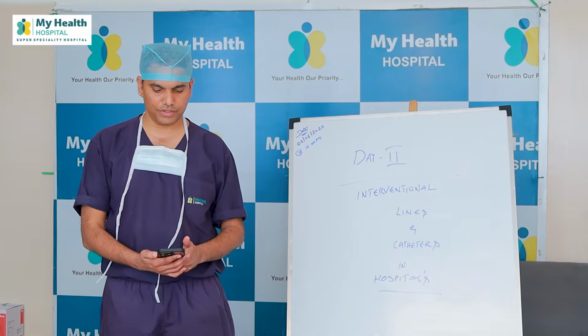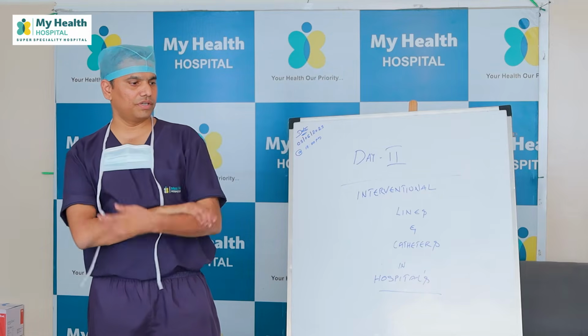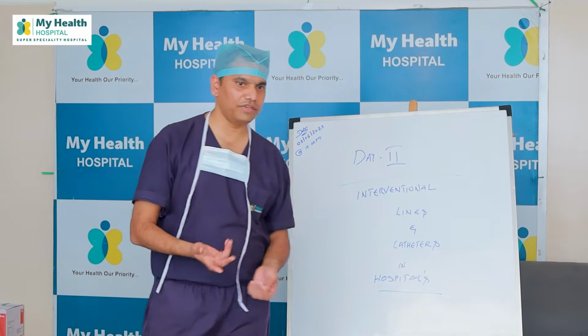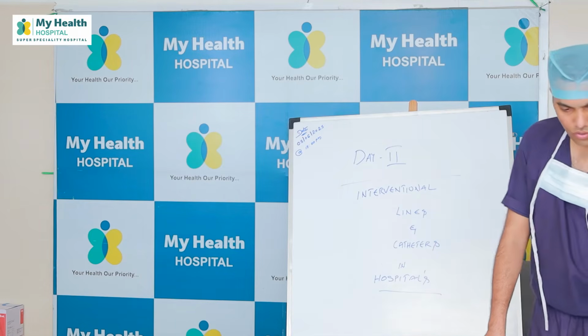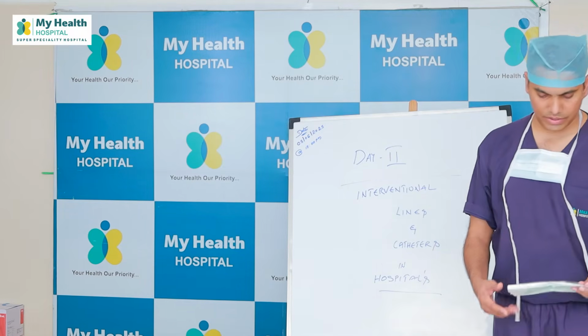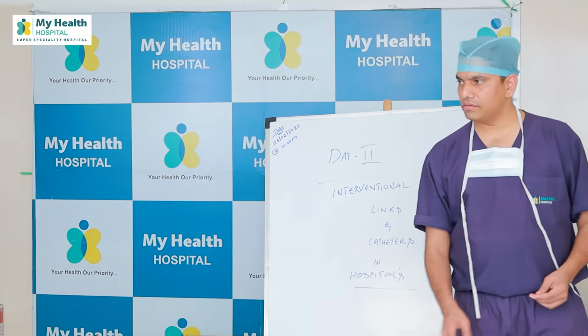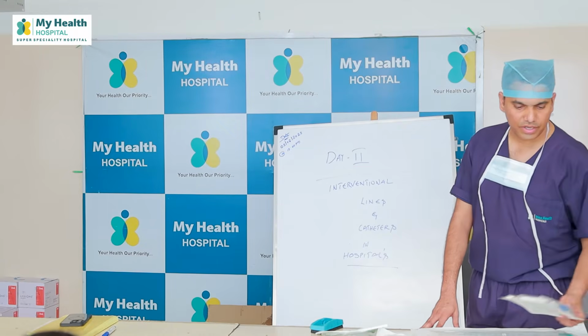What are non-interventions? Interventions. Ryle's tube is an intervention. Interventions are invasive lines. Interventions are all invasive lines. So, Foley's catheter is an intervention. ET tube is an intervention. Intubation is an intervention. Central line is an intervention.